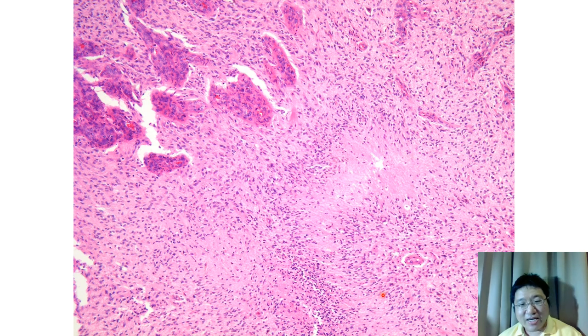And N, we see necrosis. Necrosis may look like snakes, so we call it serpentine necrosis. And because the cells surrounding the necrotic area usually align in a row, we may call this pseudo palisading necrosis. The cells seem to be organized in a row surrounding the necrotic area. So that is pseudo palisading necrosis.